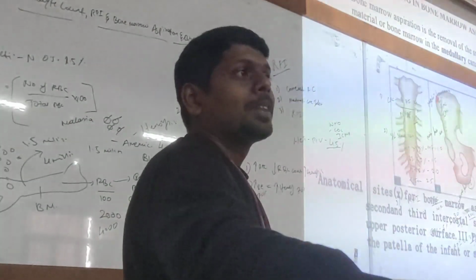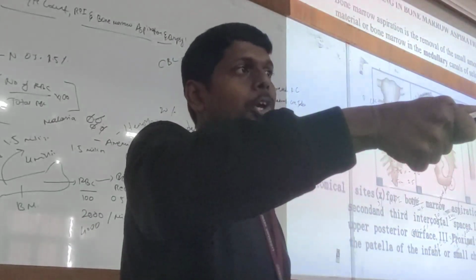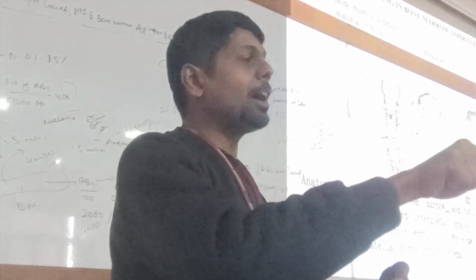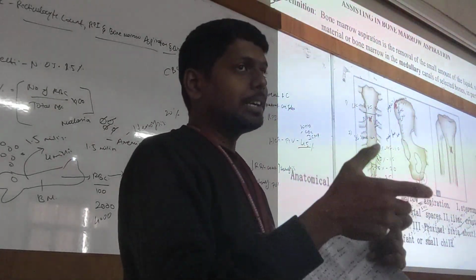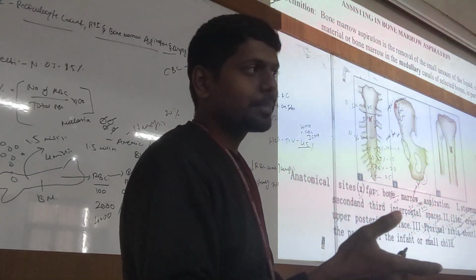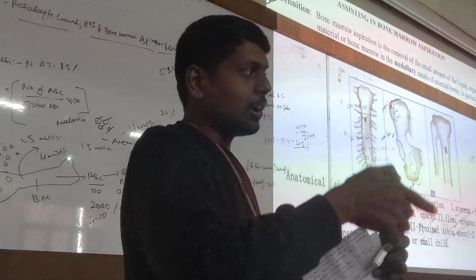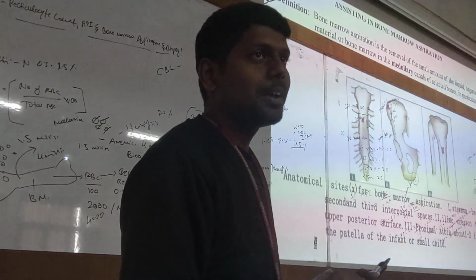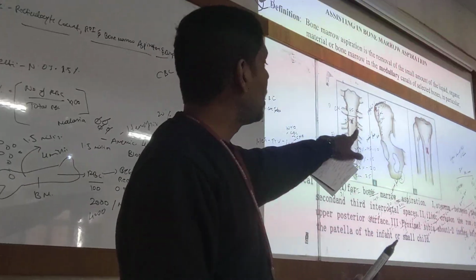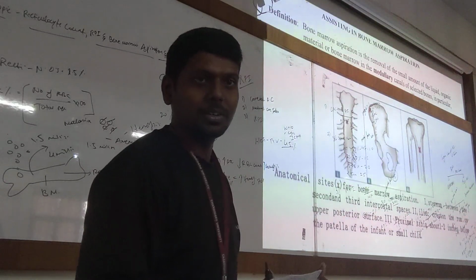Okay, now listen, class. Pay attention. Just imagine taking a very strong needle and inserting it into your bone, drilling your bone when you are alive. Keep that in mind. And collecting a sample from your bone. There is no anesthesia for bone actually. We can give anesthesia to the surrounding area, but there is no anesthesia you can give directly to the bone. And imagine the patient's pain when they are undergoing this test.